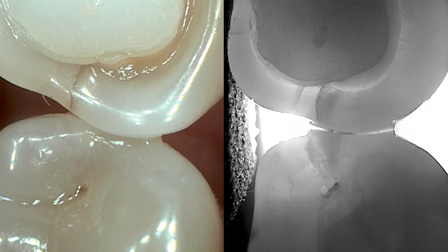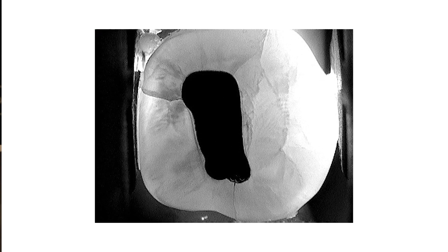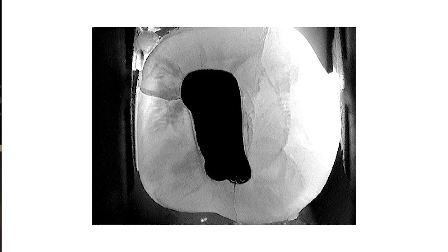Loom is also great for discovering fractures, which you can share with your patient. Here's an example with some fracture lines in the teeth coming off the amalgam — those show up very nicely.